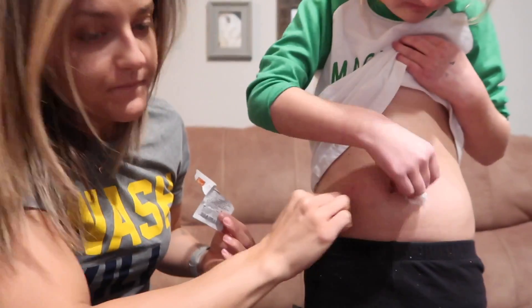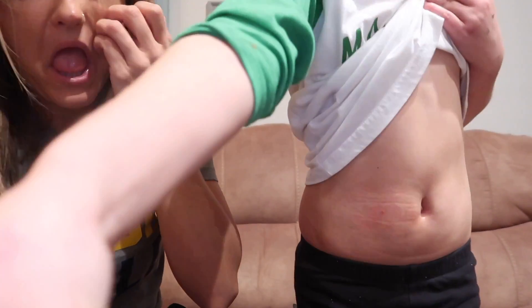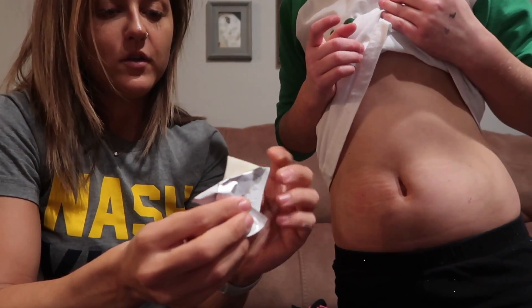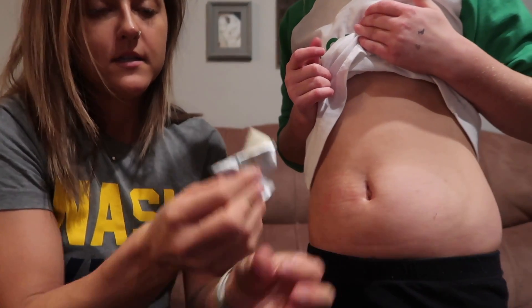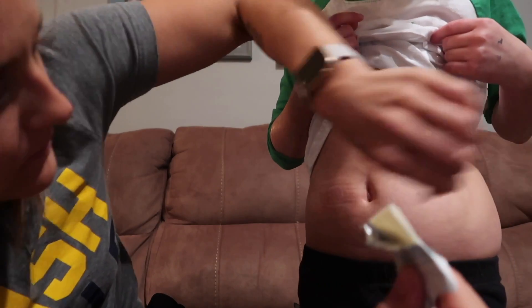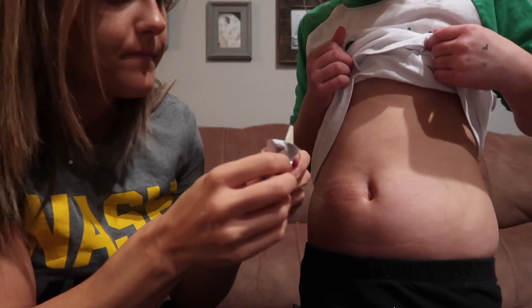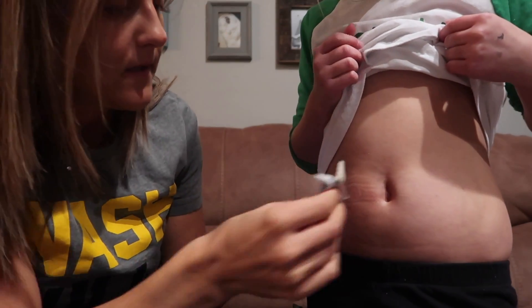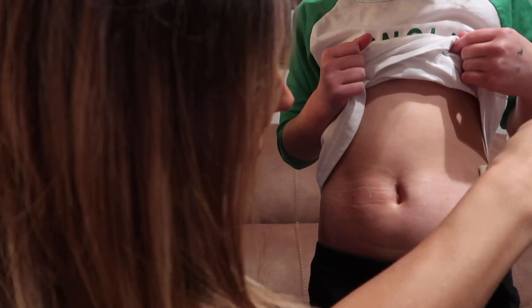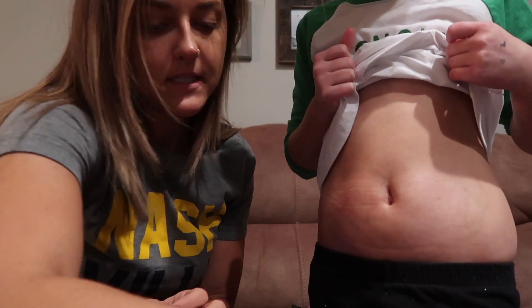All right. She's got that. Now I need to just skin tac — ripping it in half. Little tricky trick here because this stuff is so sticky. Somebody on YouTube commented to do that. Can people that aren't on YouTube comment? I think you have to have an account to comment.